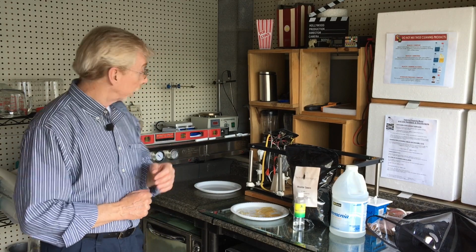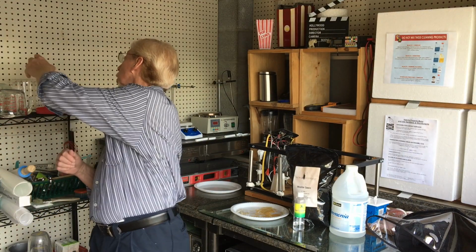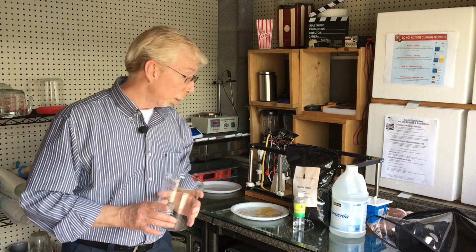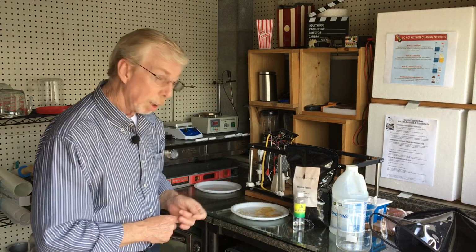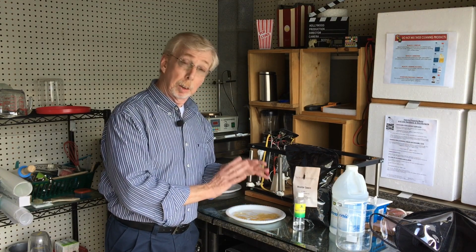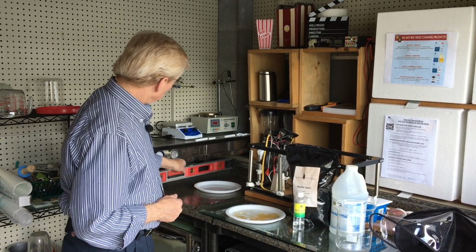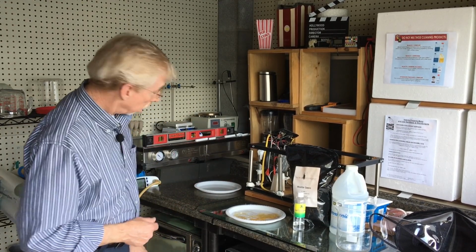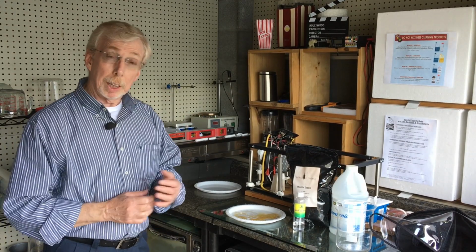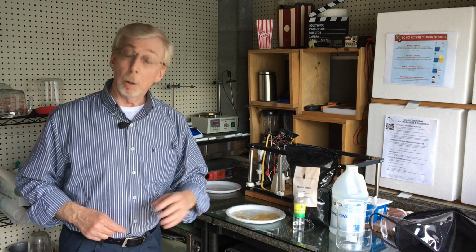Now, what I'm going to use, of course, is my lab stirrer that I have up here, and I'm going to mix it in a beaker for 24 hours. Now, after that, I'm going to pull this out and let it dry. However, here's the bug. In this batch, some of it dried thick and some of it was thin. And the reason for that is that even though I'm completely level to the eye or to this, which should be more than sufficient, well, I'm not.